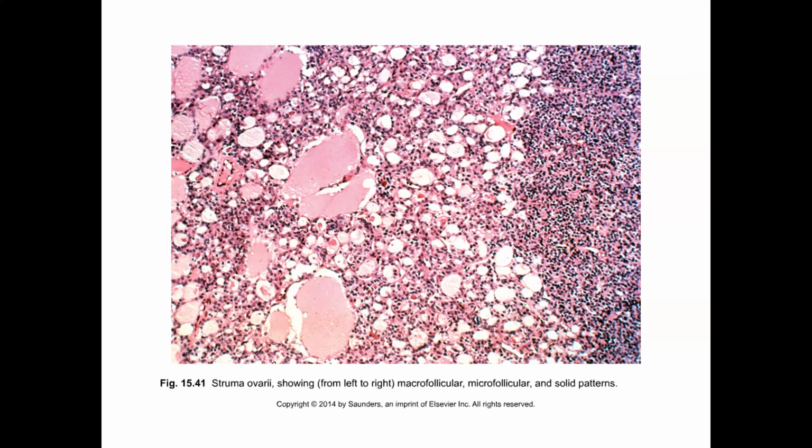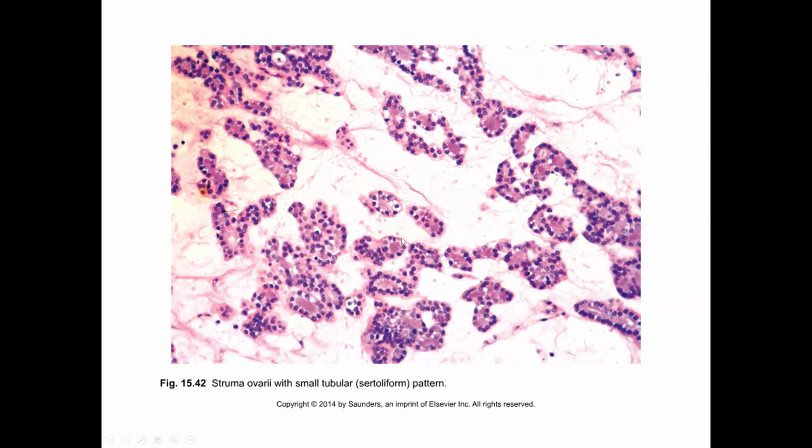Under the microscope, of course, it's going to look like thyroid tissue, and you can have variable cellularity, large, small follicles, just as we would see in various lesions in the thyroid, including small nested patterns, widely separated. And so differential considerations, neuroendocrine tumors, sex cord stromal tumors might enter into the differential considerations with this as well.